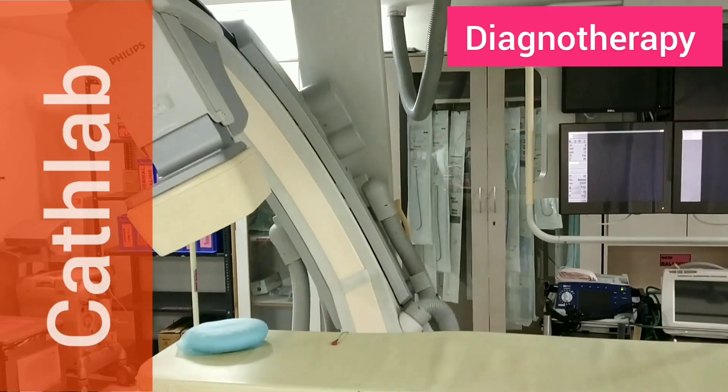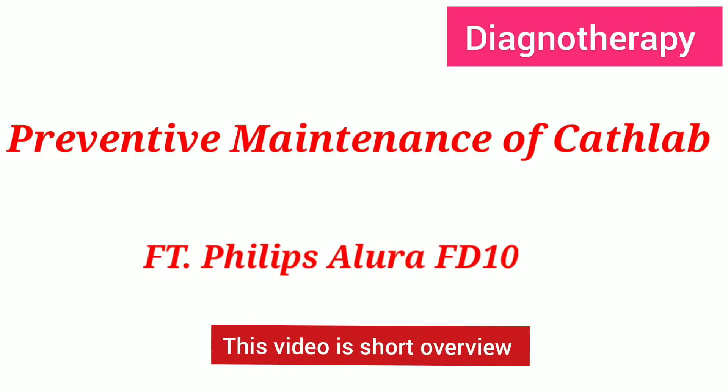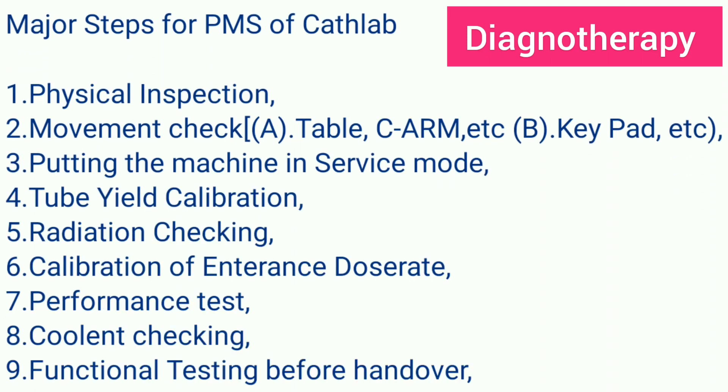In this video we will be seeing the preventive maintenance of a cath lab featuring the Philips Allura FD10. The major steps of PM of cath lab are: first, physical inspection; second, movement check of the table, C-arm, keypads, and control movements — checking whether the keypad movements are giving correct movements or not.